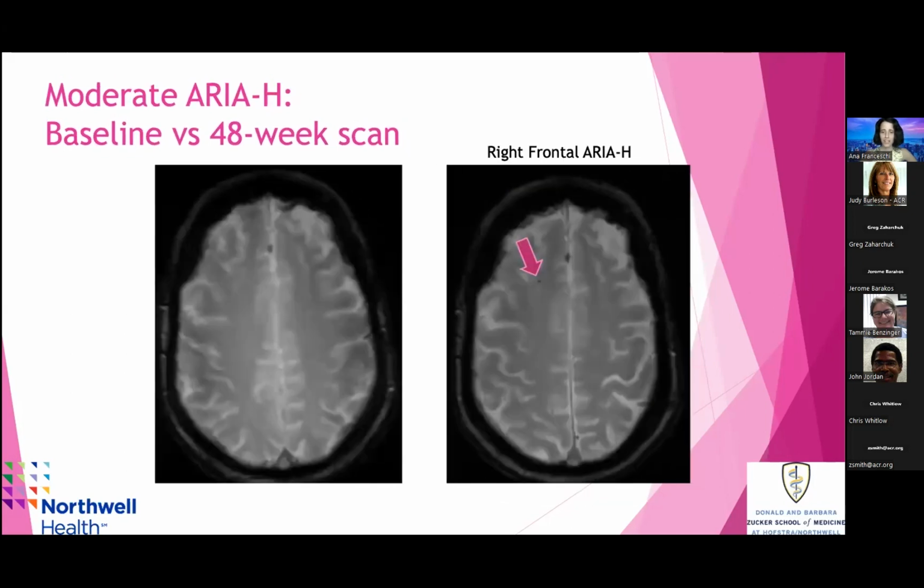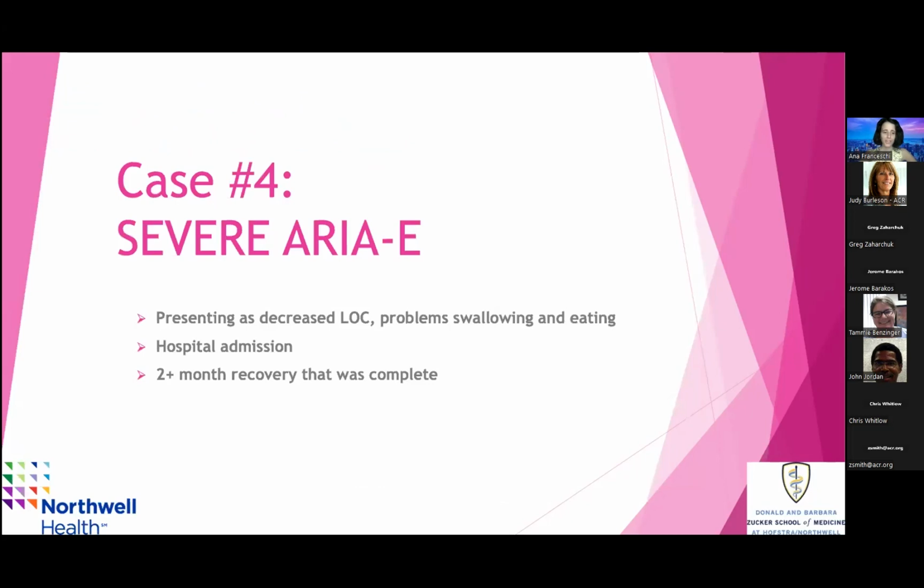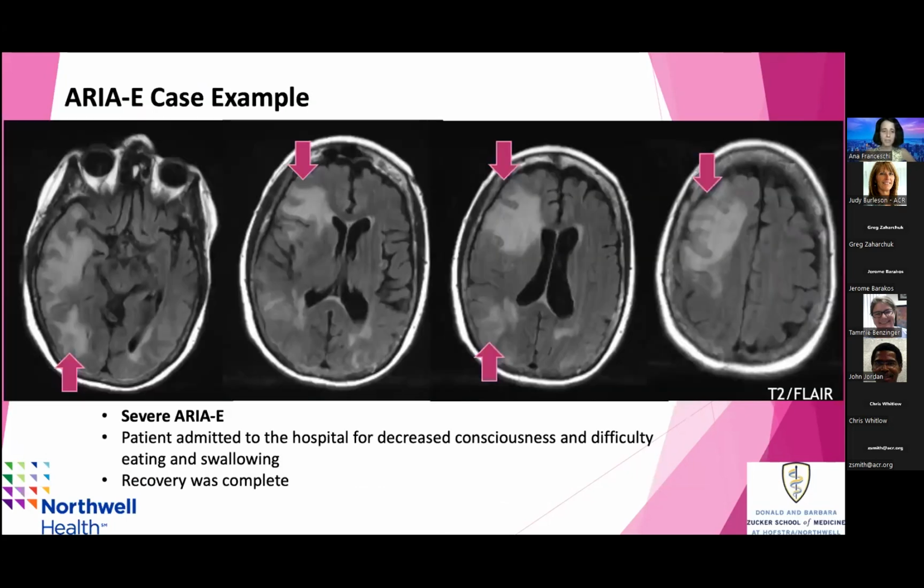Okay, so the next case is an example of severe ARIA-E. This patient was admitted to the ICU. They initially presented with loss of consciousness, or decreased consciousness, I should say, problems swallowing and eating, and in fact went on after a 2-month hospital stay to a complete recovery.